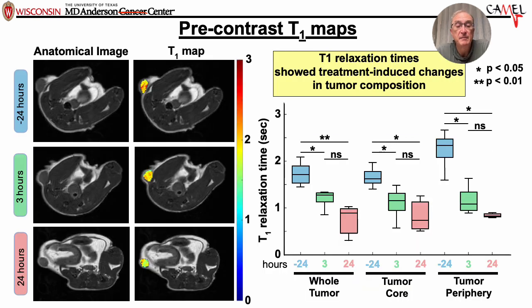Okay, the pre-contrast T1 maps were calculated, which is necessary for both the Tofts and the LRRM analyses.